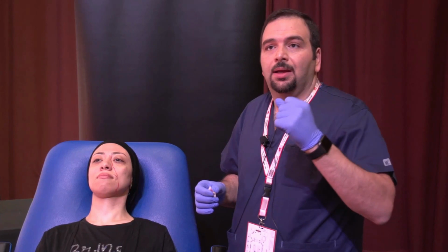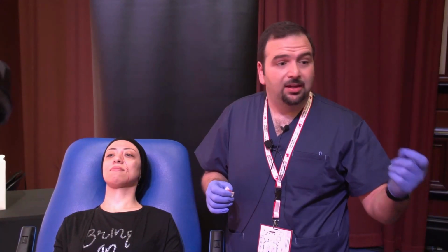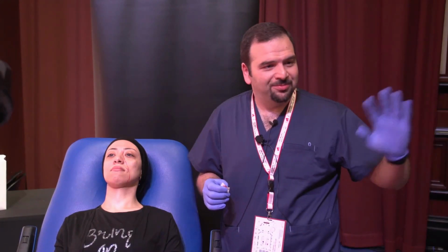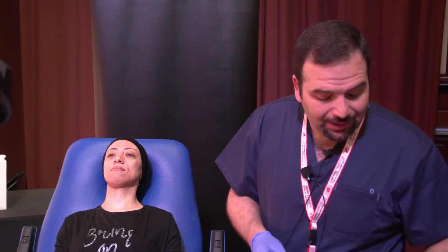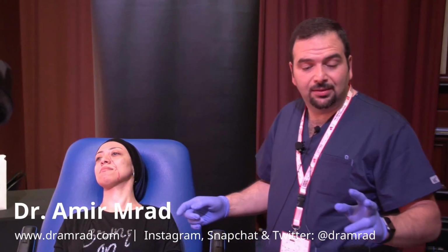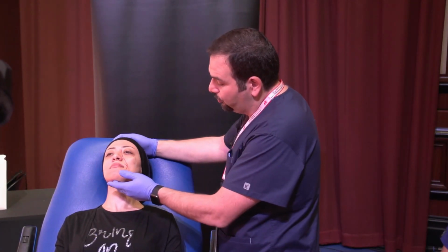And it's the same thinking process for my fillers and my implants. If the patient needs a small implant, it's usually a half to 1 cc. We have small, medium, and large. Very simple again, 3 products. The small, half to 1 cc. The medium is 2 cc's, and the large is 3 cc's. Okay? So we've demonstrated the cheek, we've demonstrated the angular mandible, and now we go to the chin.